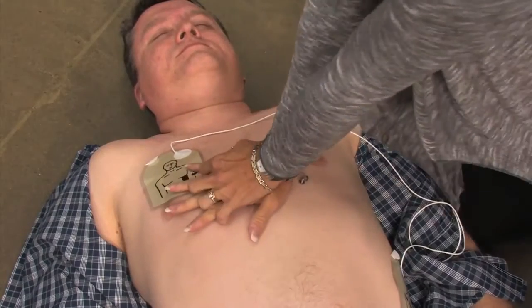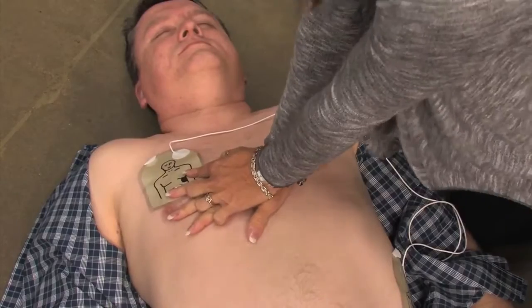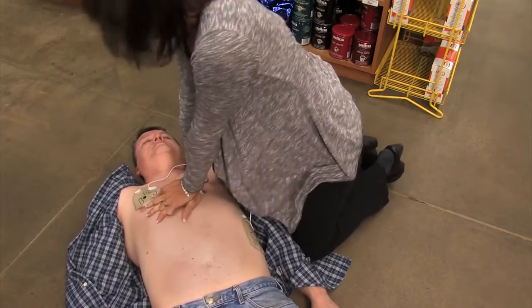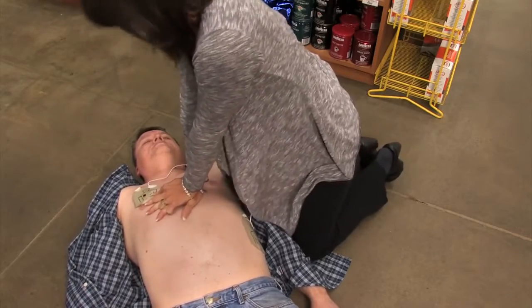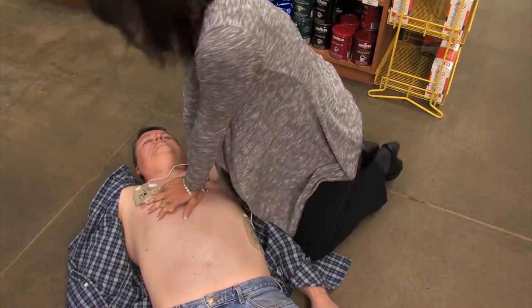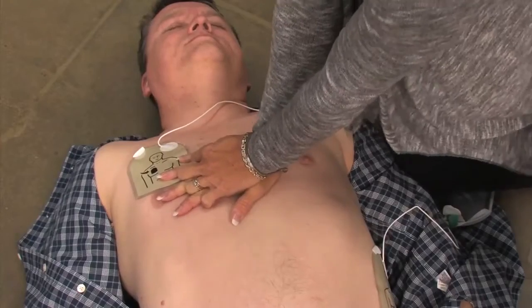Place overlapping hands in the middle of the chest. Press directly down on the chest in time with the metronome. Remain calm. The combination of CPR and defibrillation is the best rescue technique you can practice until medical professionals arrive on the scene.